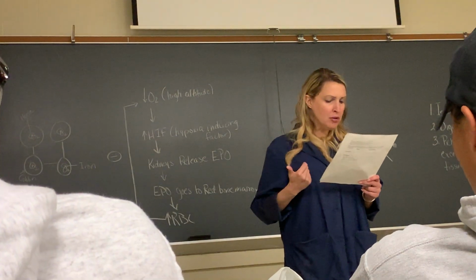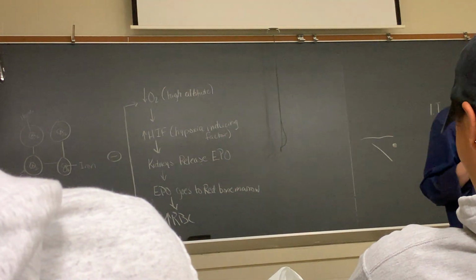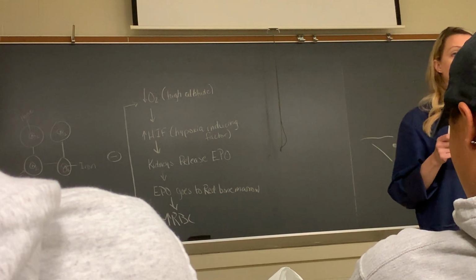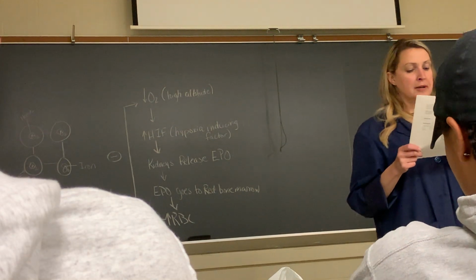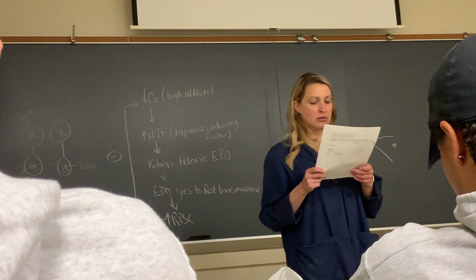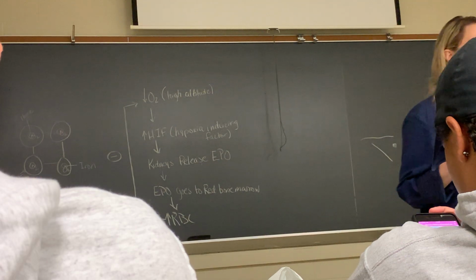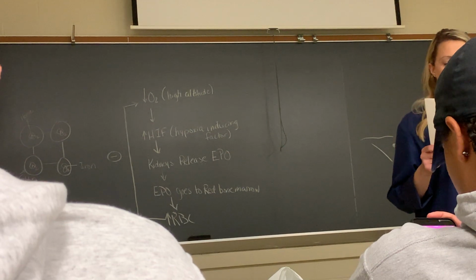Okay, so hemoglobin, we're looking at the color, so it's a very simple test. Notice that for females, the normal range is 12 to 16 grams per deciliter. Actually, that's the correct unit in terms of how we measure now, so you can cross out the grams per 100 mil on there. Just know the range 12 to 16 grams per deciliter for females, males 13.5 to 17.5 grams per deciliter. It's important that you learn these values and also the units that go with the values. That's important to put all of it.